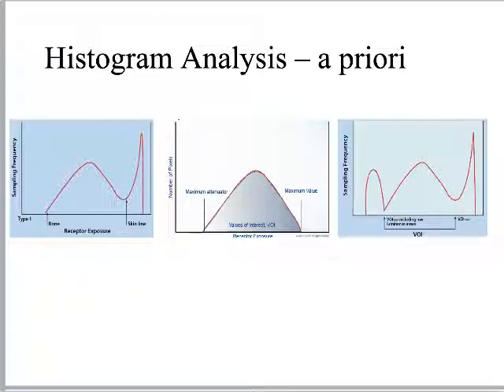Can anyone guess what that third spike is there on the image? It's background radiation, right? So it's the extremely dark stuff on the image. Again, not interested. So only the values of interest are included in the area that was imaged.